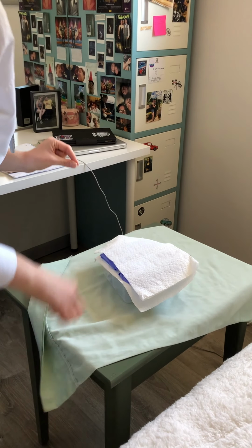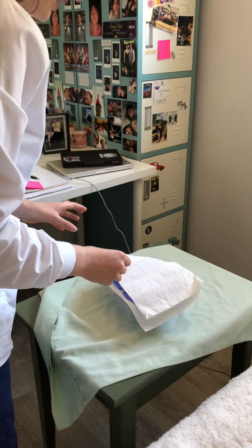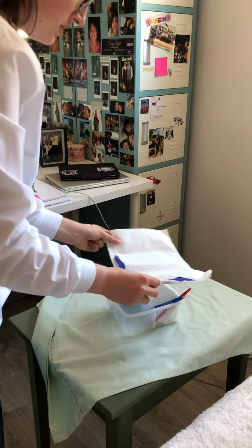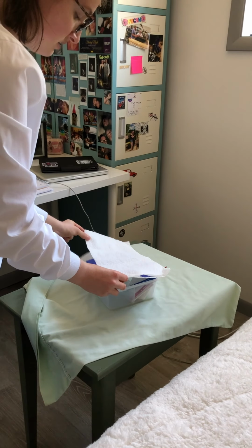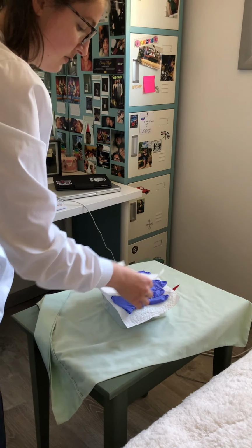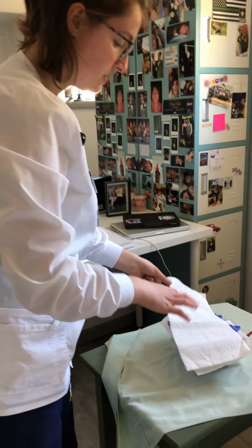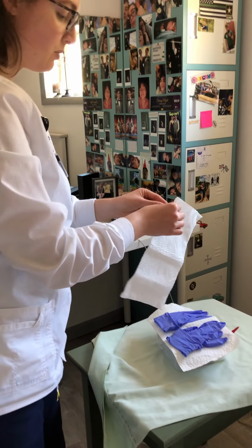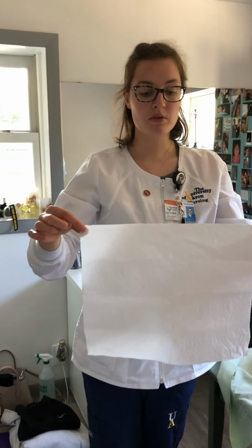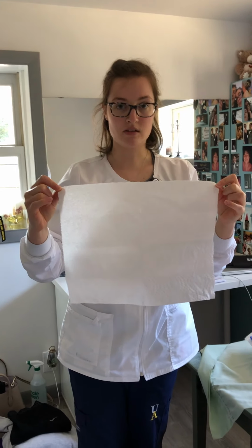Okay, so the first thing we have in this kit is the clean gloves, which I don't need right now, so I'm just going to go ahead. Oops, it's easy. It is kind of, nope, we had the cloth first, my bad. So it is kind of hard to maintain sterile field when you don't have all the right things. But, so we're going to go ahead and place this sterile cloth over the patient. I'm trying to keep it away from my body so that I don't contaminate it. I'm holding it at the corners. I'm going to place the shiny side down.